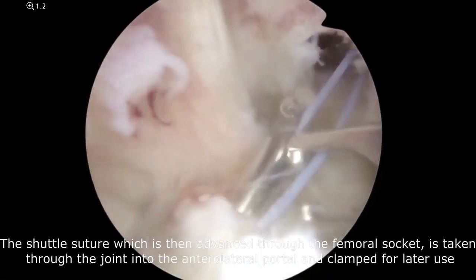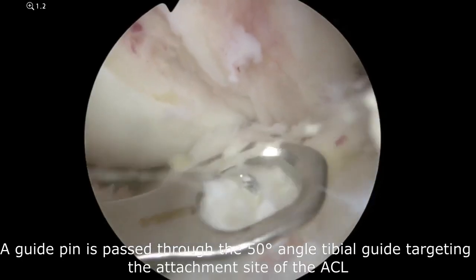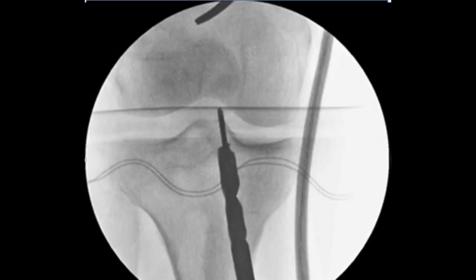The shuttle suture is taken through the joint into the anterolateral portal for later use. A guide pin is passed through the 50-degree angle tibial guide targeting the attachment site of the ACL. The 8 mm reamer is advanced over the guide pin until the tip of the reamer is within 3 to 4 mm of the tibial articular surface under fluoroscopic control.